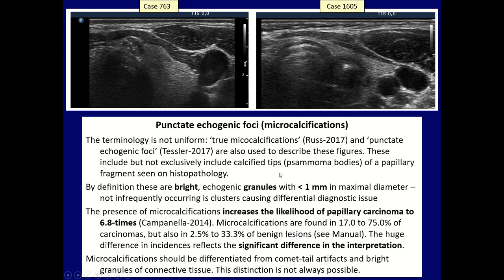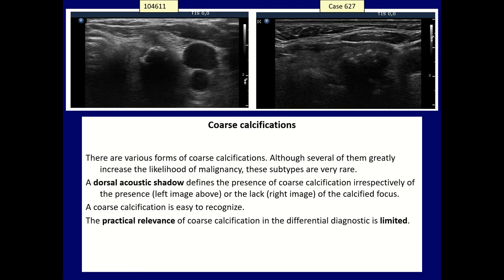The other form of calcification is the coarse or macro-calcification. These can be present in goiters which have been found for decades and can represent a normal degenerative process. Nevertheless, coarse calcification also increases the likelihood of malignancy, but to a much lesser extent than microcalcification.